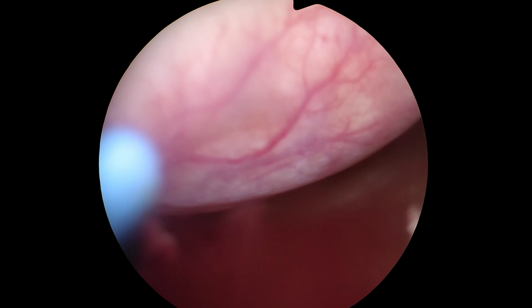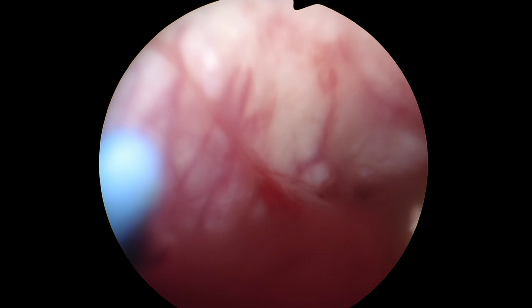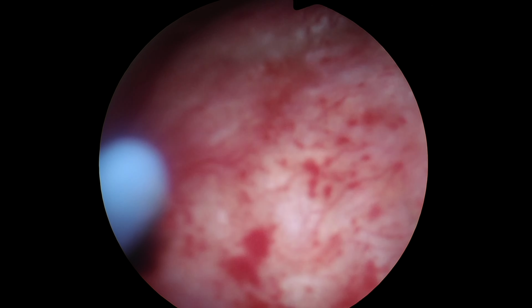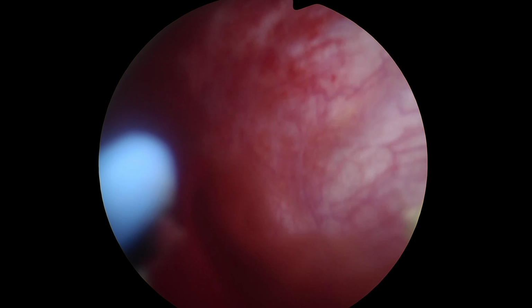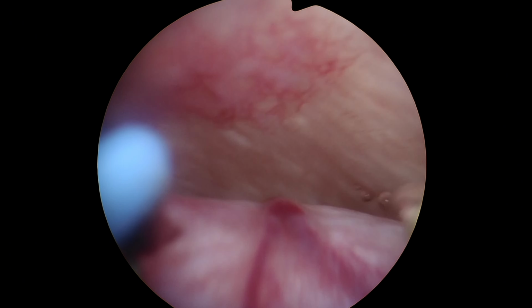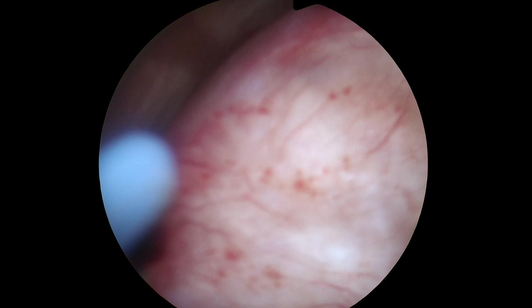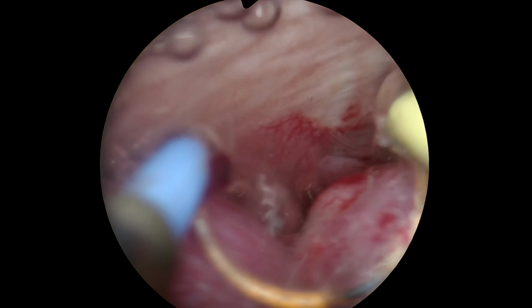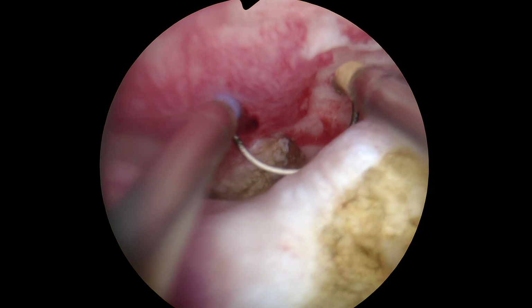This is a case of hysteroscopic submucous myomectomy, a myoma measuring almost 6 centimeters, in a premenopausal woman with abnormal uterine bleeding and moderate anemia. And so the question arises: how to start the resection of the fibroid in order to reduce the operation time and for the maximum prevention of possible complications.